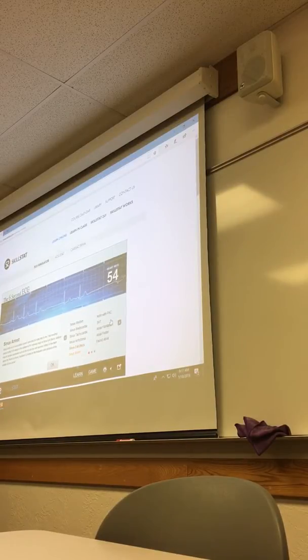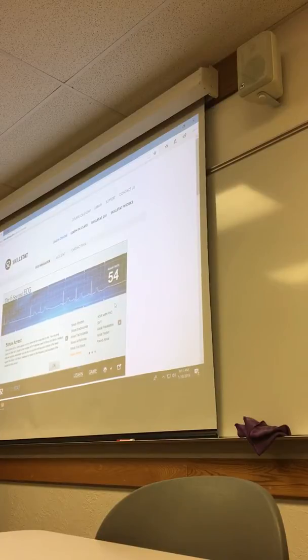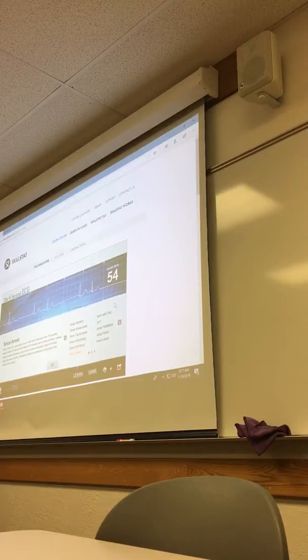Okay, if I do the P wave to P wave, then it's off. It's off. Not all of them go. This is why you'll see the nurses on the floor measuring things like this. You're usually just looking at that, and you have to make sure things measure out. How am I supposed to know that it's not exact? Because 0.04 of a square is really, really small, and nobody can really figure that out just with your own eye. You've gotta measure that out, and so that's why those calipers are here. Okay, let's go to some atrial rhythms here.